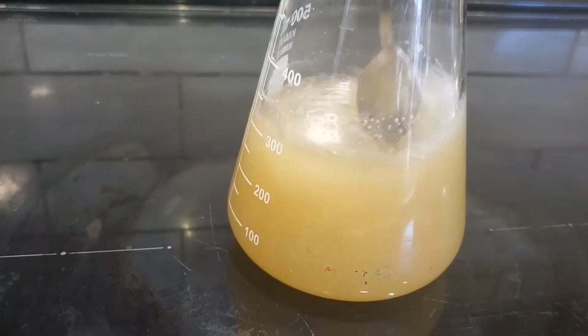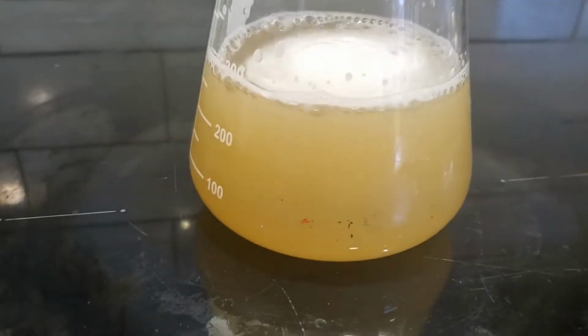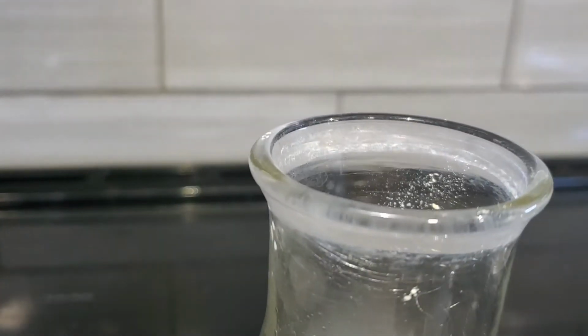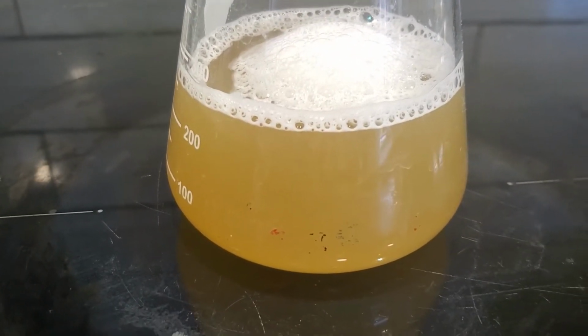So I've just been stirring this occasionally here, and we're at the point now where it's just at a nice warm temperature and I'm not seeing any chunks left in there whatsoever. So we're going to say that that is nicely mixed. You can see there's just, well, I can see anyway, there's just a little bit of steam coming off of this here. So it's time to fill up those vials.